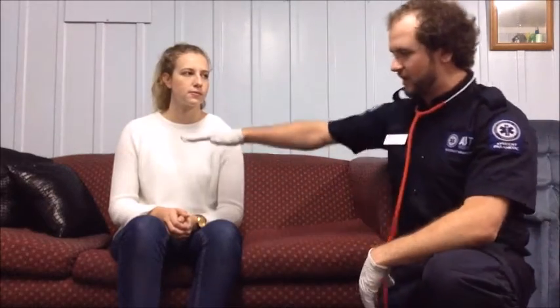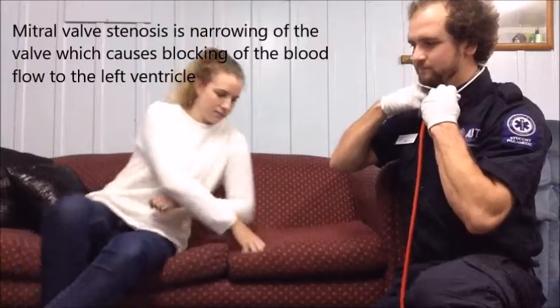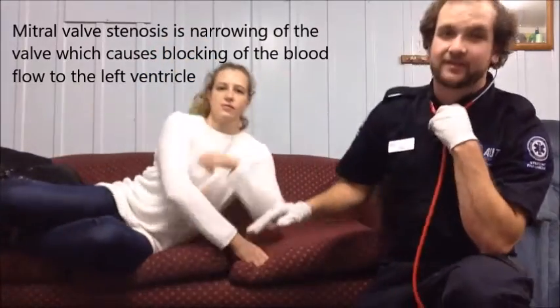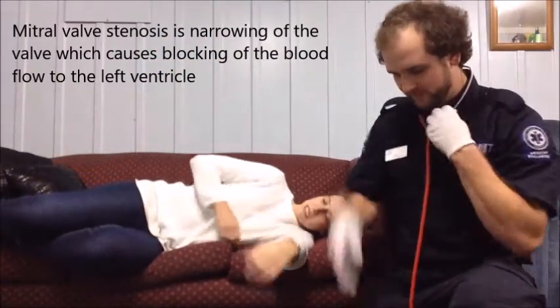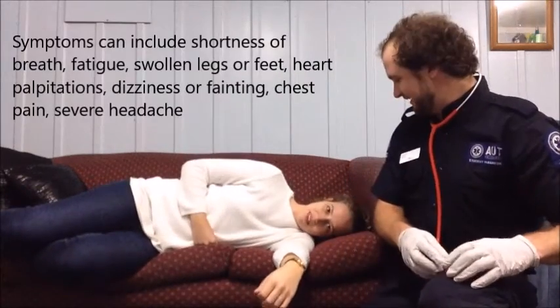We're now going to do some accentuation maneuvers. These cause certain murmurs to become louder during expiration. So, Ashley, if you could just lie down on your left-hand side. What we're going to do is locate the mitral valve again, and we're using the bell end of the stethoscope. Are you comfy there? Yep. Okay.